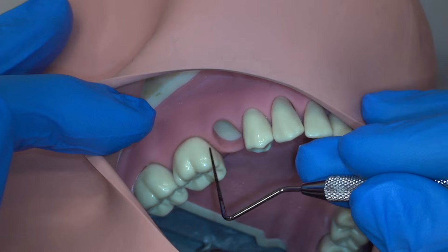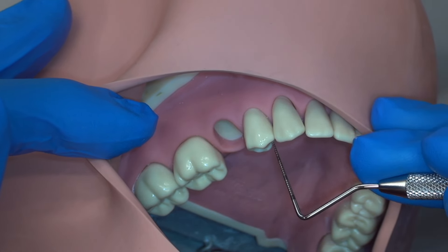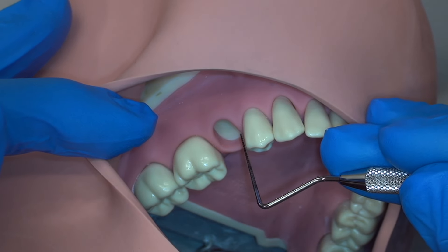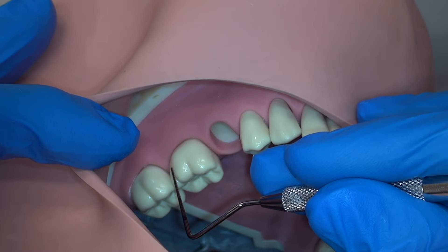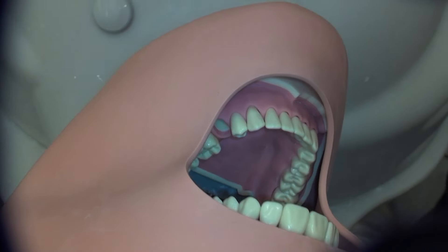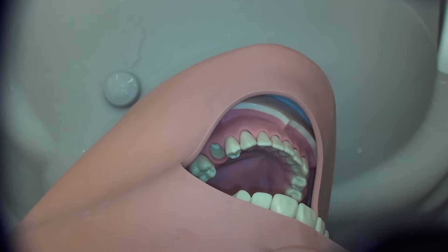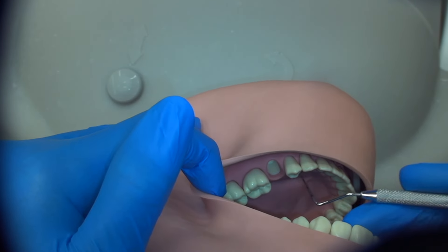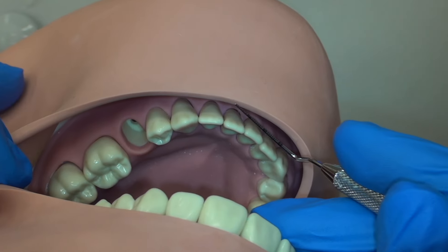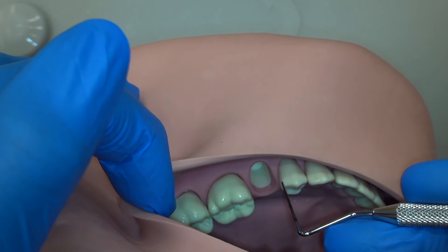Our preparation will begin with the interproximal separation, for which we will use the buccal view. In this view we can also see the mid-buccal surfaces of the tooth to begin with our mock finish line, as usual. I recommend sitting in the 10 to 12 o'clock position for the entire procedure so that both hands can be utilized. Additionally, for lower posterior teeth, it is possible to view the majority of the preparation from a more occlusal view, looking down the long axis of the teeth, as shown here. It is even possible to view a portion of the distal lingual finish line from this view.